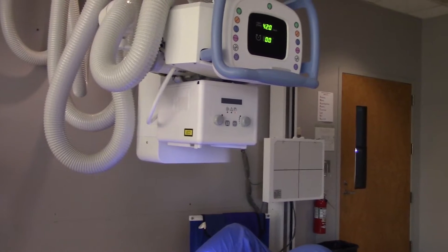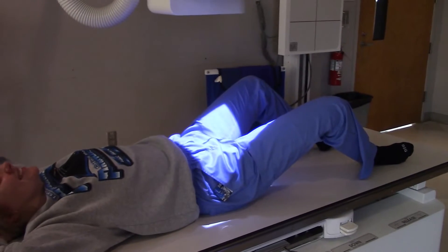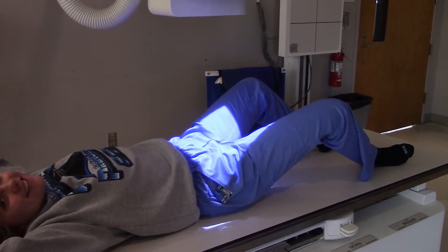He was smart though, he was very smart. Okay, so let's take a look. Ms. Emily, walk us through what you got here.